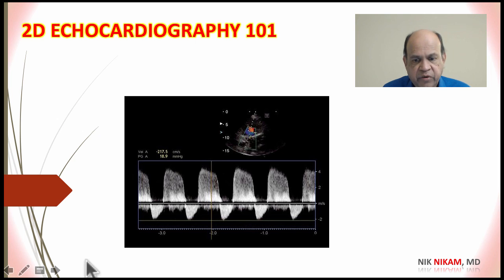While we are talking about aortic valve disease, here is an example of an aortic regurgitation where the blood is backing into the outflow tract. This is the 5-chamber view, and this is a systolic waveform, and here is a diastolic waveform which should not be there, which is pathological. Here we see a significant degree of aortic regurgitation represented by this Doppler.